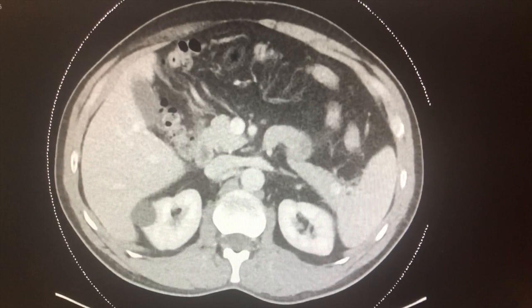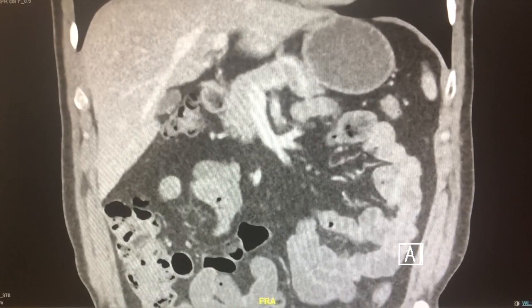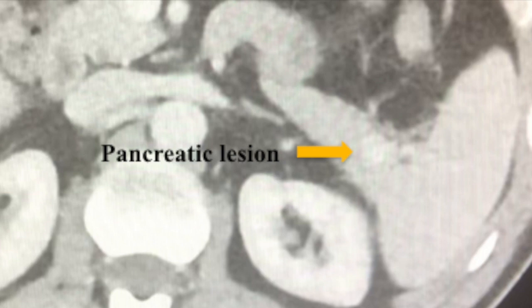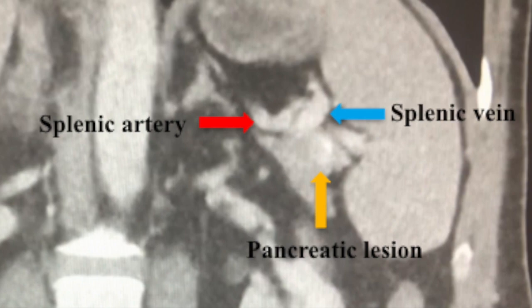In the coronal views, we can appreciate the mass in the distal aspect of the pancreas in close approximation to the splenic artery and vein. In this enhanced view, we can see the mass in close approximation to the splenic hilum. And in the enhanced coronal view, we can see the location of the lesion in relation to the overlying splenic artery and splenic vein.